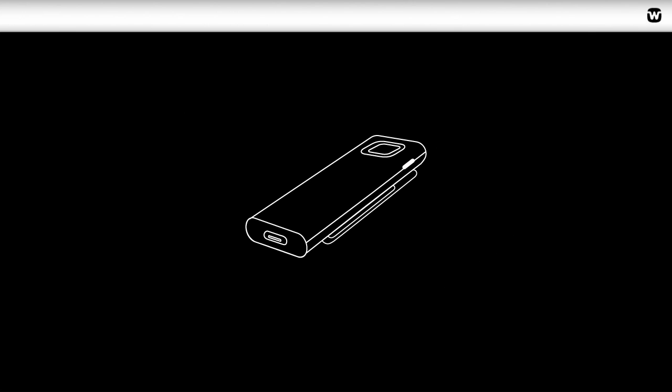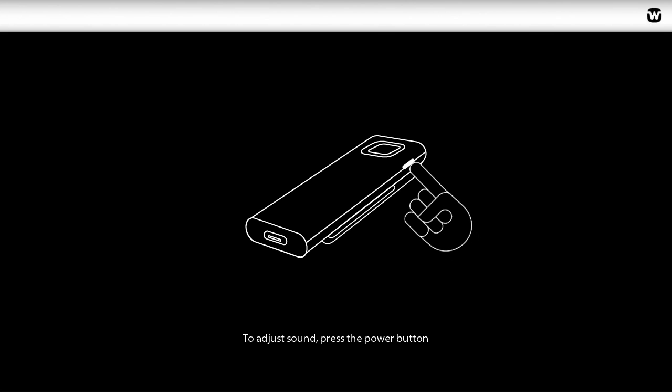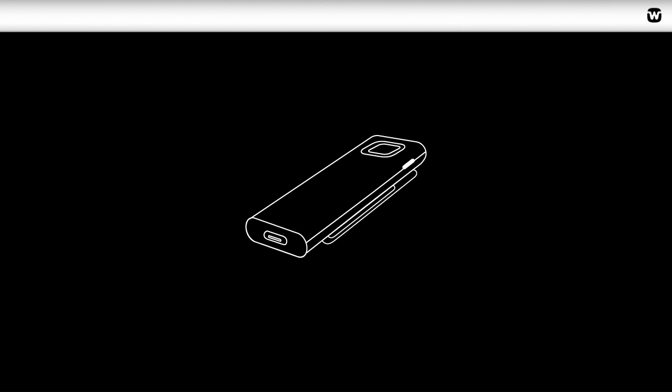You can adjust the sound streaming from the Remote Mic to your Comdex by three levels. To switch between each level, simply press the Power Button on the side of the Comdex Remote Mic briefly. The sound level is indicated by a blue blink.